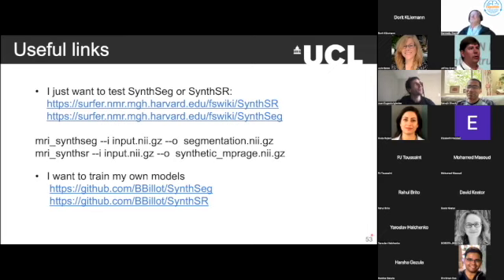Right. I didn't go into this, but the robust version of SynthSeg runs SynthSeg first with only 4 classes, like a simplified tissue model. That segmentation sometimes breaks. Sometimes it has holes, sometimes it has topological problems. But we push that through an autoencoder that gives you a topologically correct version. Too smooth normally, but correct. And then we use that as a prior for a second SynthSeg with all the labels. So I'm wondering if the autoencoder can be used for this in some way.